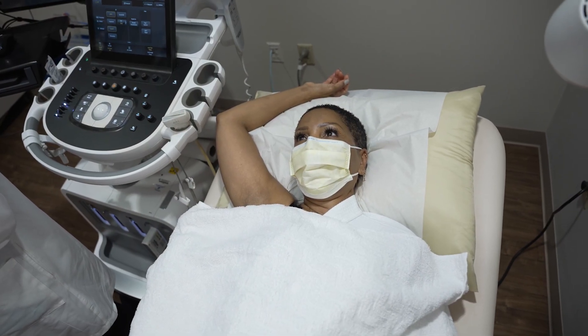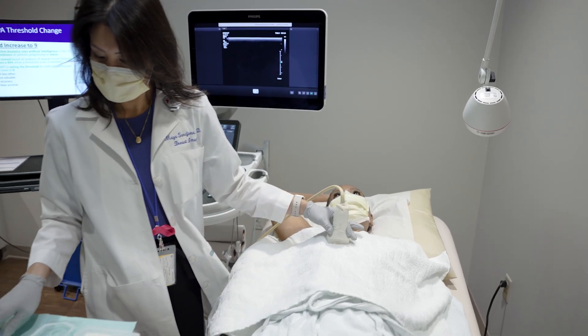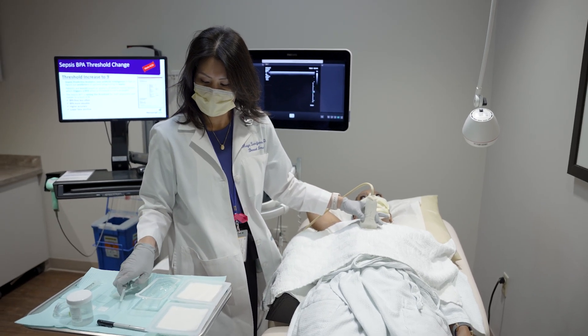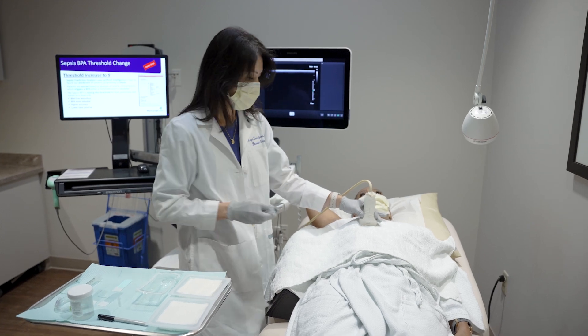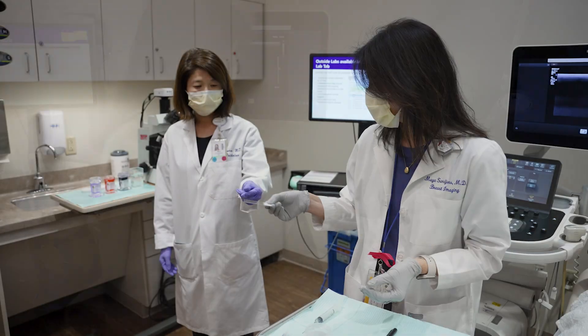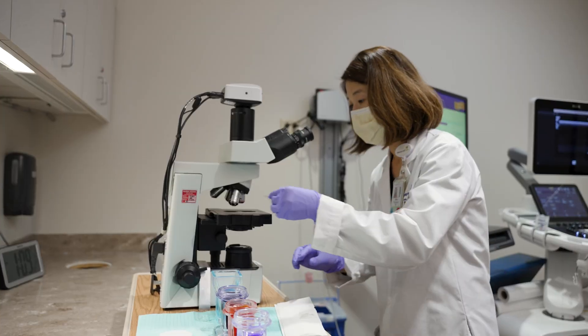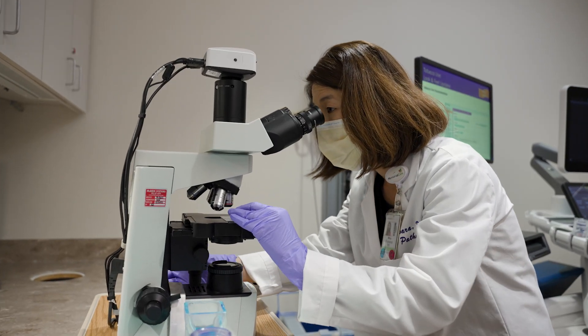You'll lay on a bed next to the ultrasound machine, and the doctor will give you a local anesthetic, which can sting. Using ultrasound guidance, the doctor will insert a very fine needle into the lesion to obtain a tissue sample. An accompanying pathologist will immediately review the samples under a microscope to ensure the sample is good enough for testing.